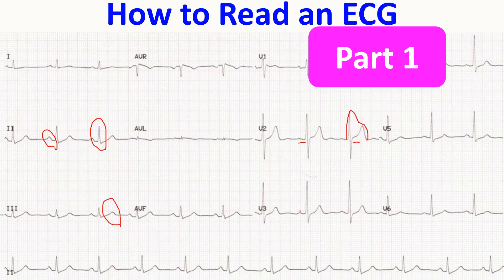From one P wave to another P wave — more precisely, from the onset of one P wave to the onset of the next P wave — that is the PP interval. From the onset of one QRS to the onset of the next QRS, that is the RR interval.